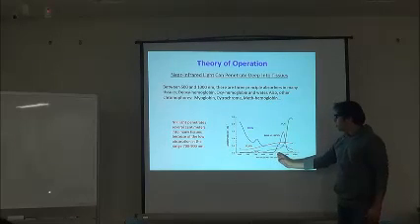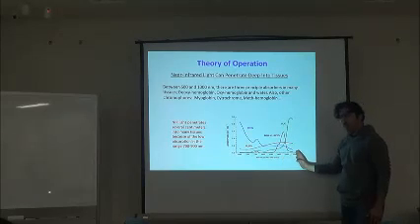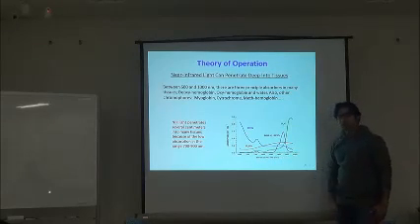And also, if we go beyond 900, you can see that the absorption because of water is quite high. So that's why we don't usually go beyond 900. We usually use from 650 to 900, not even 1,000.